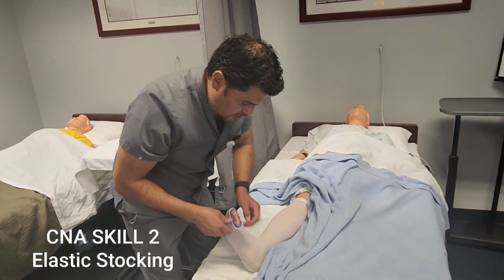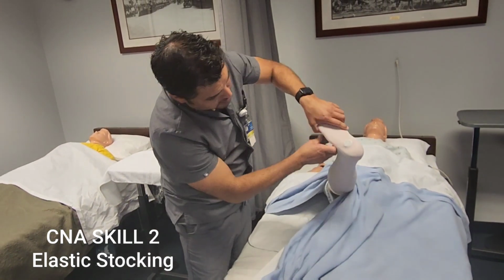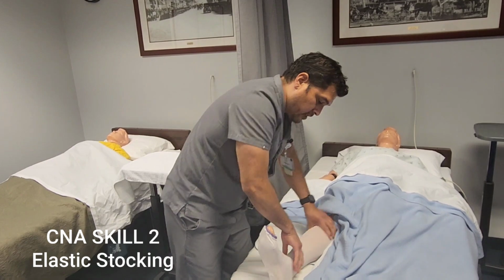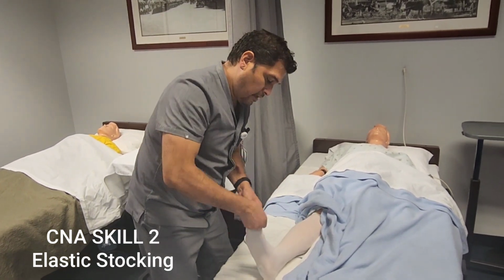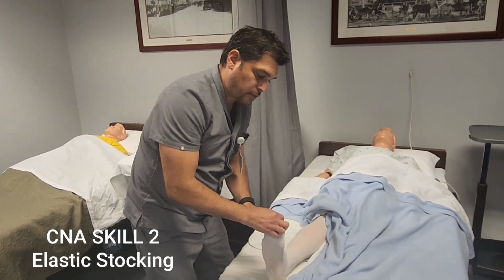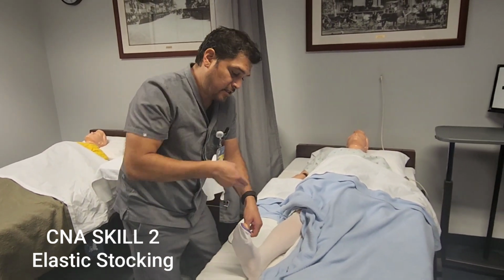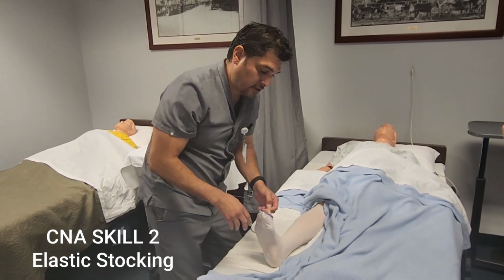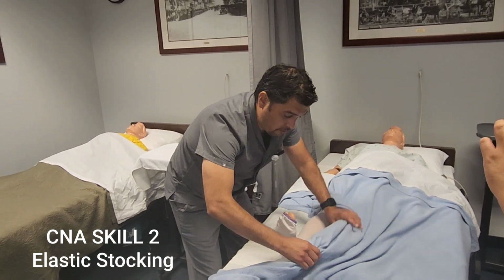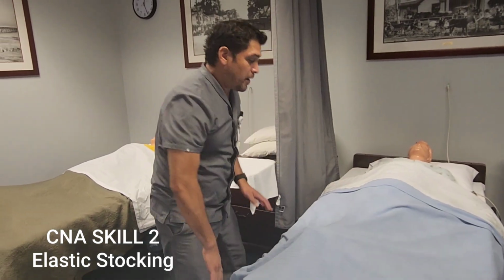And I'm going to inspect the sock just to make sure of a couple things. That the heel box is at the heel of the patient and that there are no twists and no wrinkles, okay? The top of this exposure of the foot, it's okay for this little hole to expose the toes because remember, this is going to be used to either palpate for a pulse, or if I need to get a Doppler, I can put the Doppler in there and take a look at the activity of the arterial. So I'm going to go ahead and now cover the patient back up. Now the patient's all covered up.